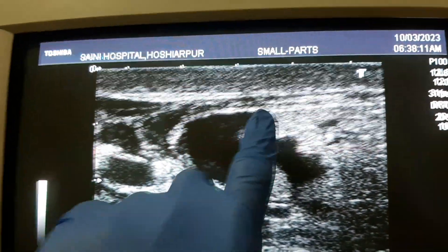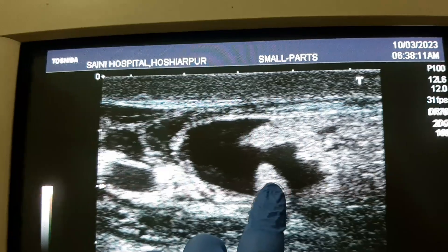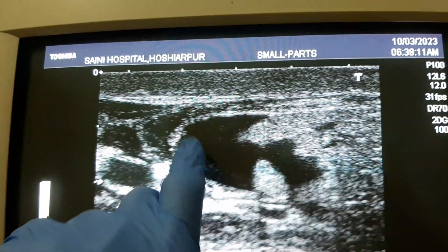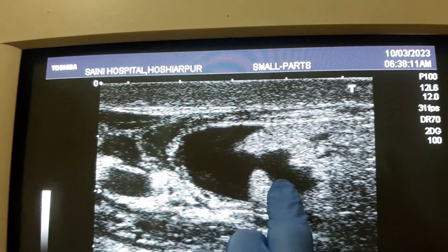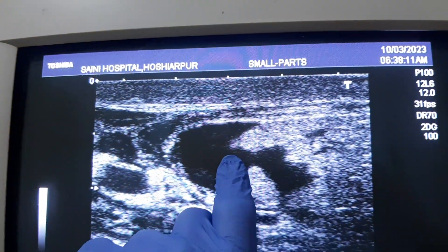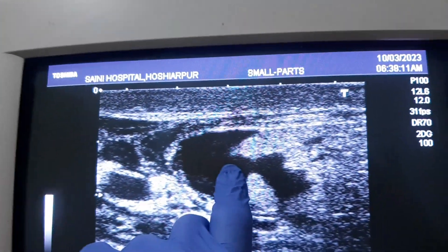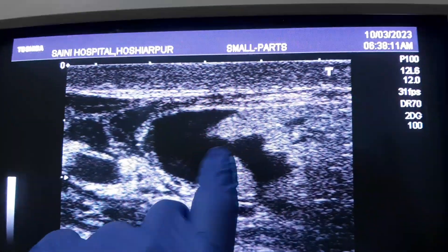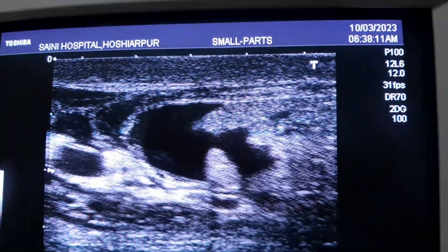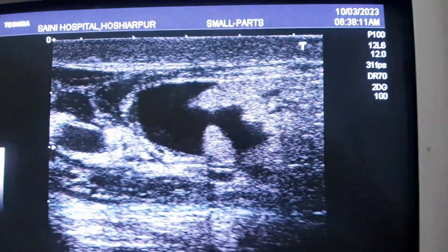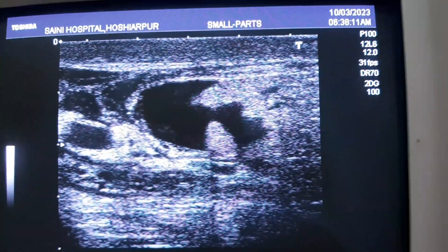Obstructive hernia with omentum content in the inguinal area. This part shows some fluid, which indicates some obstruction. If you check the vascularity, it is there. Here it is tested — you can see the testis here also.